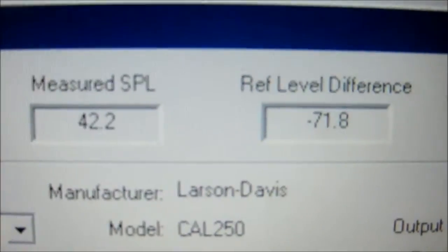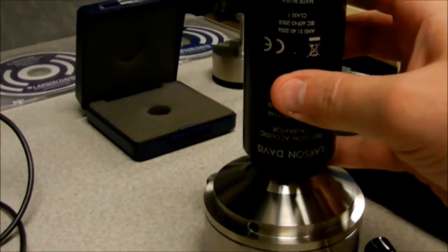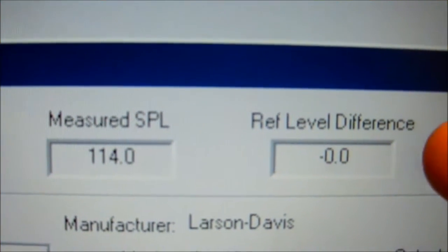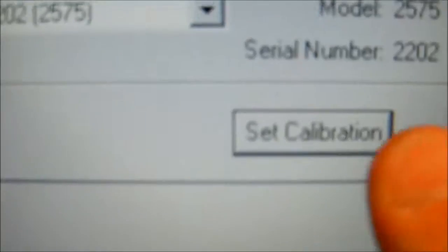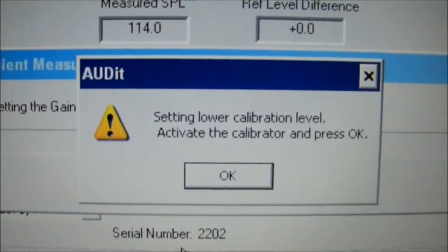Up here is our sound pressure levels. So right now we will take the calibrator, place it on top of the artificial ear and press the black button here. We basically look for the reading here. We should be 114 at zero. If it's anything other than that we would hit set calibration, which we will do that anyway. And it says setting lower calibration level.